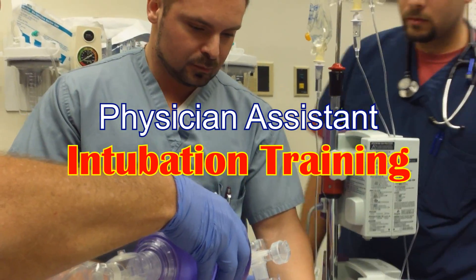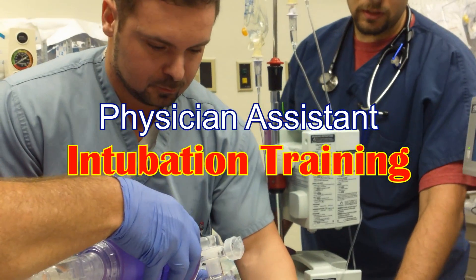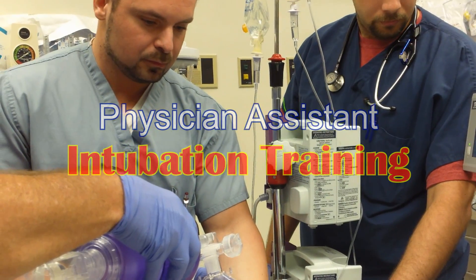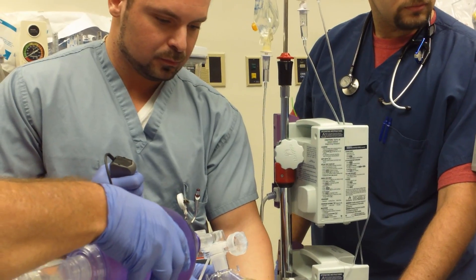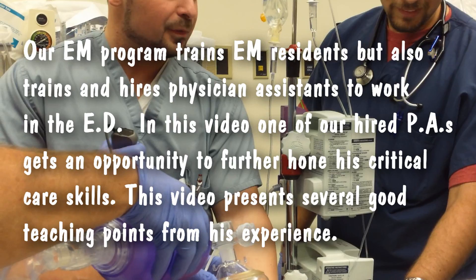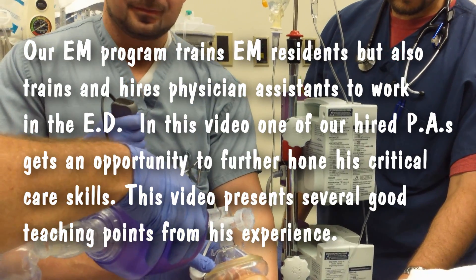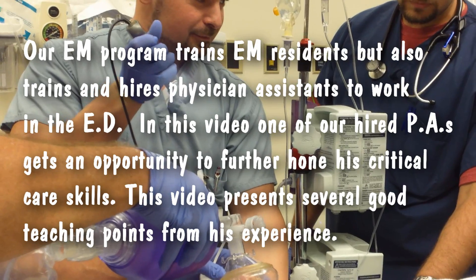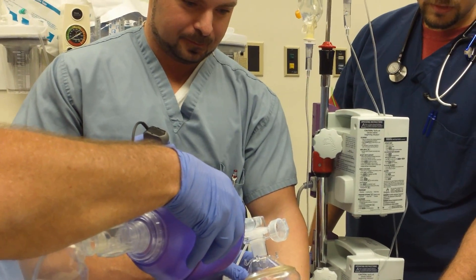We want to get her a nice setup. We'll wait for her to start fasciculating here. Hi Bobby, see you on camera right now. Go on the camera. Who's got a video camera? She should start fasciculating here.